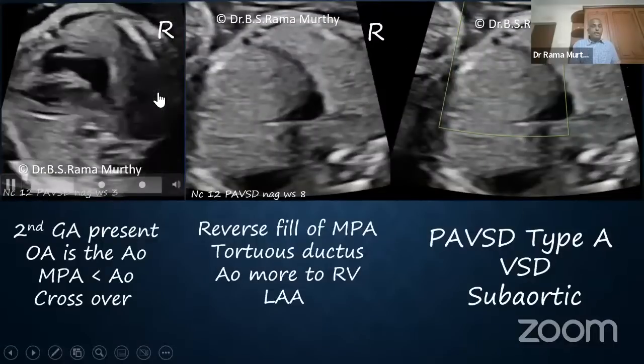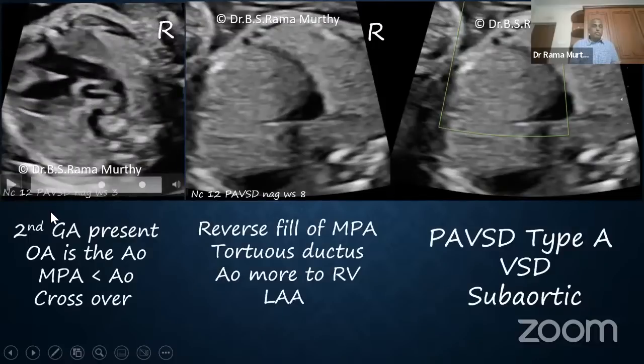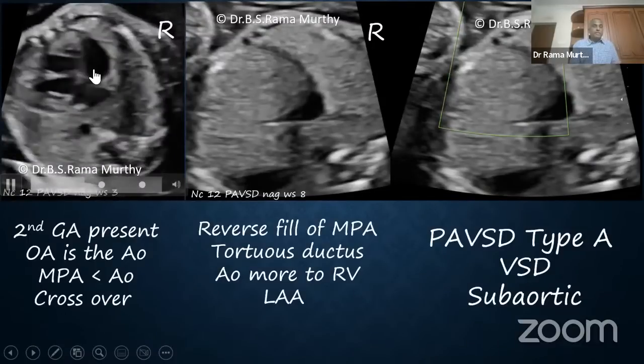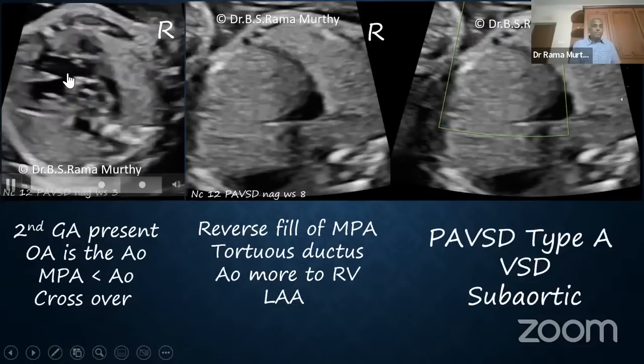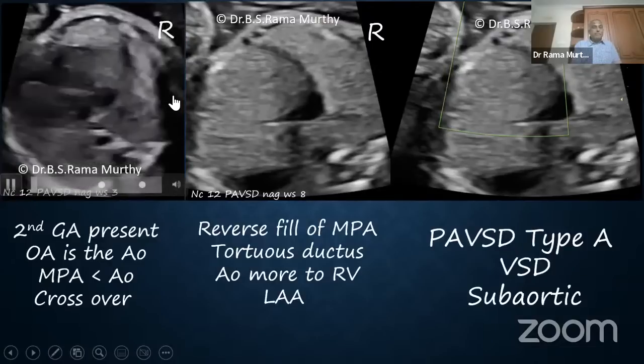So here you find a 4-chamber view to start with, and the 4-chamber view looks rotated. Let me play the clip. Looks a little rotated, a left axis rotation, and then I move into the LVOT. You find a classical overriding, and this is an arching aorta, right? Is there a second artery? That we will have to sort out. And in the same clip, I want you to see that there is a second artery, which is a little tortuous. I'll play the clip for you.